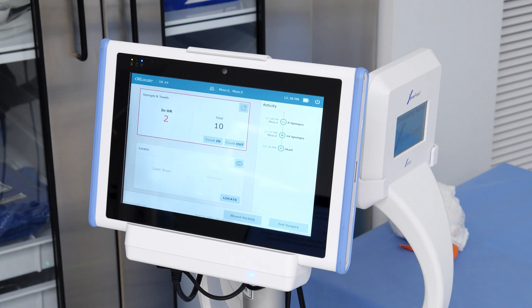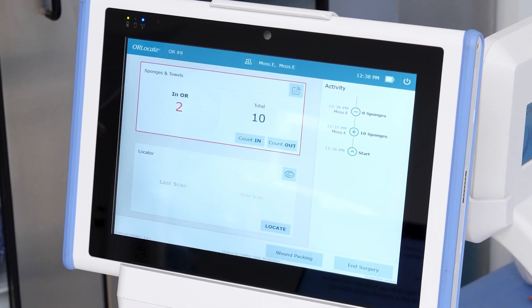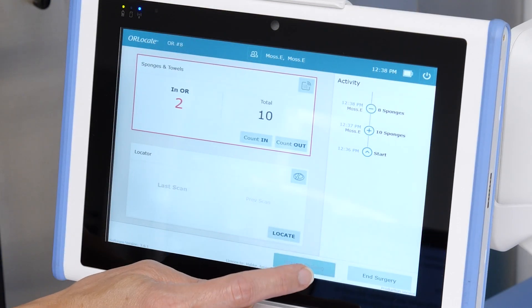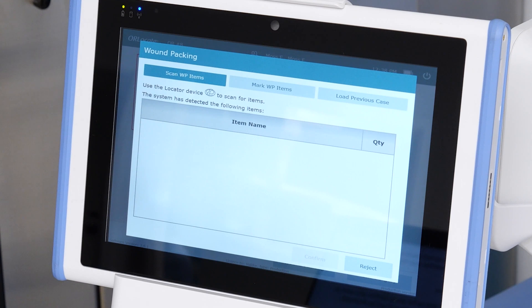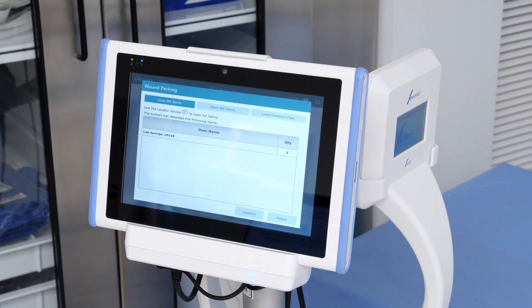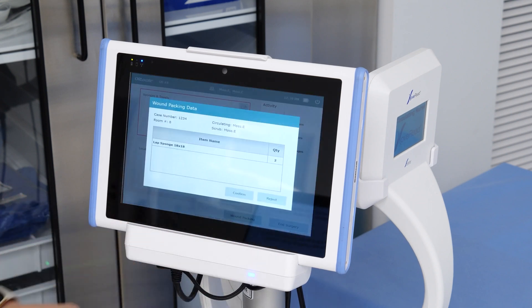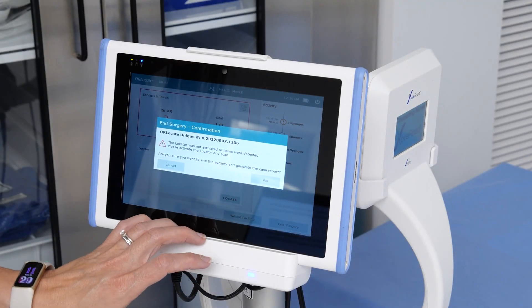If wound packing is performed during surgery, OR Locate provides a way to track these sponges between cases correctly. In this scenario, we have counted out all sponges except for two that will be used as wound packing in the patient. To log these as wound packing sponges at the end of the case, click the Wound Packing button and the wound packing screen will appear. Three tabs are located across the top: Scan Wound Packing Items, Mark Wound Packing Items, and Load Previous Case. Click Scan WP Items and scan the patient with the locator wand to locate the two wound packing sponges. Audible tones from the locator wand will indicate the sponges were found. Review the wound packing sponges on the OR Locate screen and click Confirm. When you end surgery, a pop-up box will appear to confirm the wound packing data. Click Confirm if correct, then click Yes to confirm and close the case.